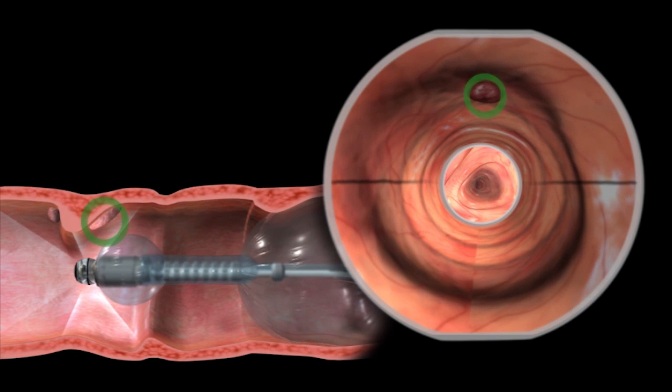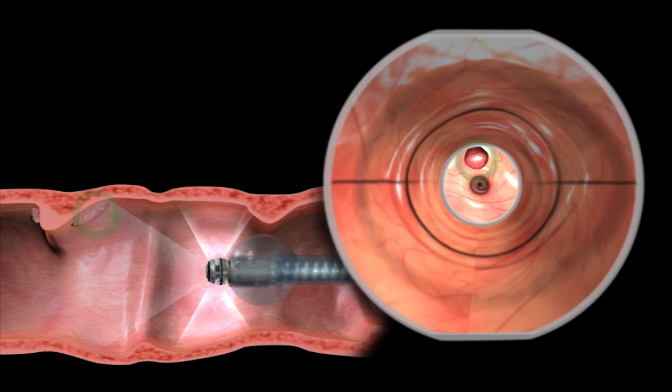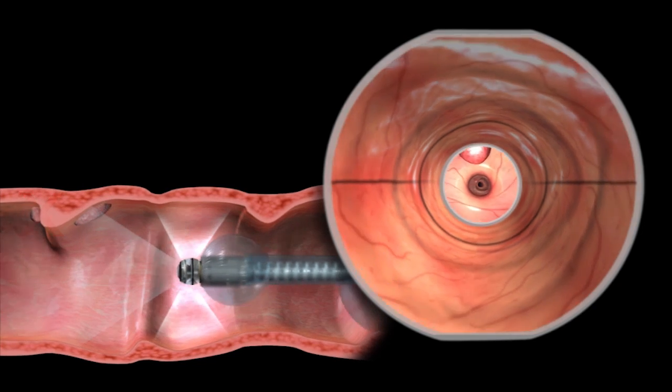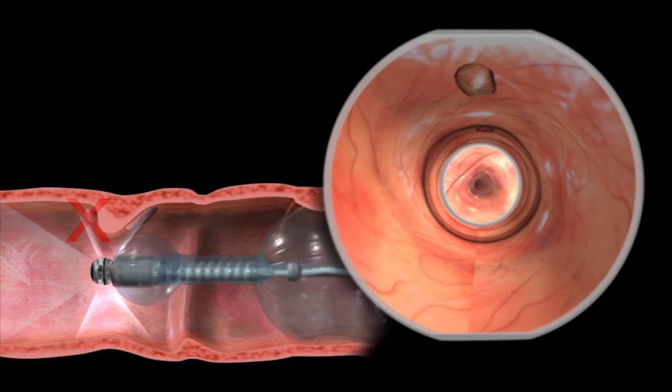While scanning the colon, polyps are visualized in the Omniview and then the front view. Some polyps seen behind folds in the Omniview may not be visible in the front view.